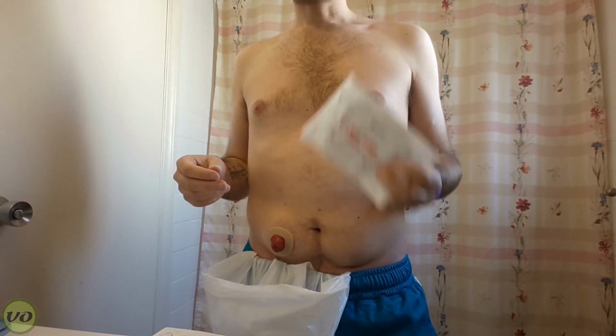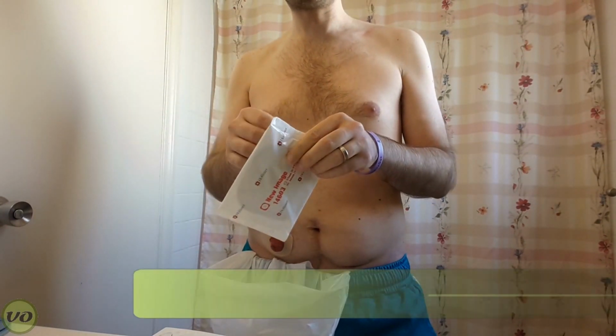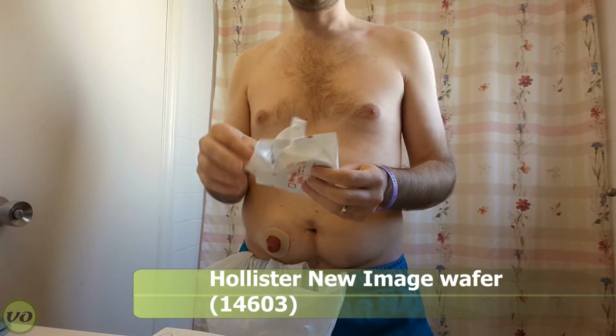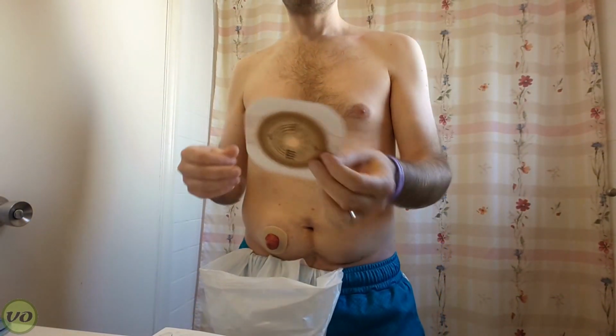Now the next step is to take your wafer and cut a hole in it, if you don't already have one that's pre-cut. The product I'm using today is from Hollister. It's the New Image 14603. Now these are cut to fit.